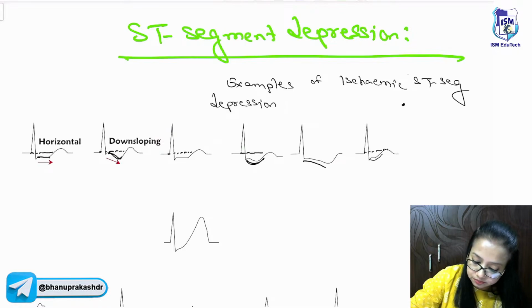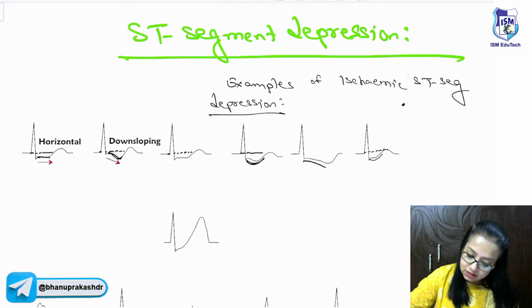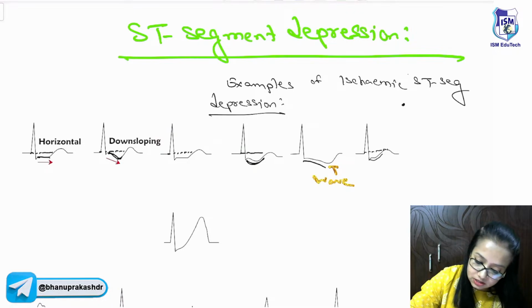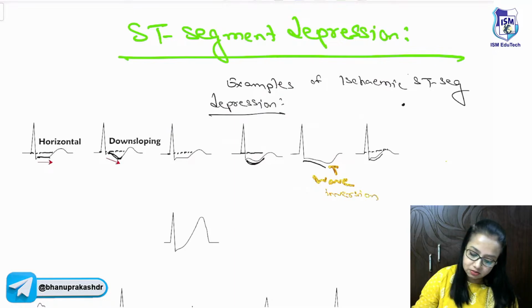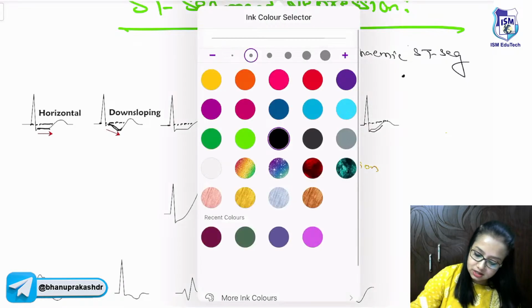depression. Now here, if you notice one more thing, in this condition there is also the T wave inversion. T wave inversion.